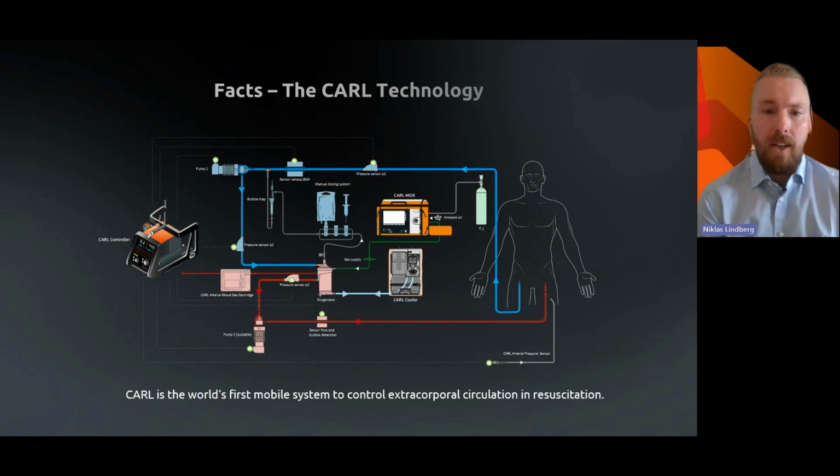From the post-oxy side, it's where the most interesting parts are happening in the CARL setup. Here we have the possibility to use the blood gas cartridge if we are in an environment where we want to control the blood gases. Of course, if you're in the clinic and you have access to your point of care devices, you don't need it. Pressure number 3 is post-ox pre-pump 2.